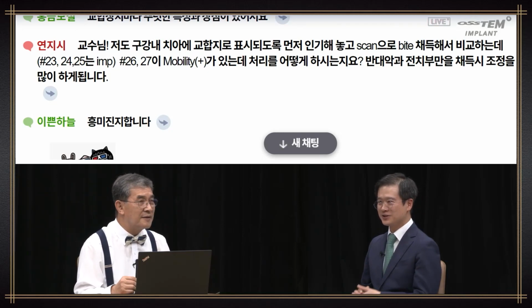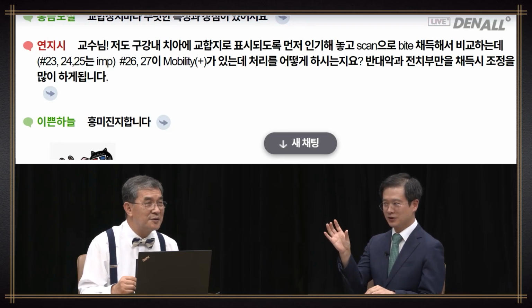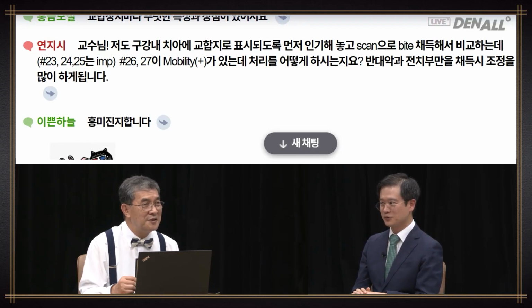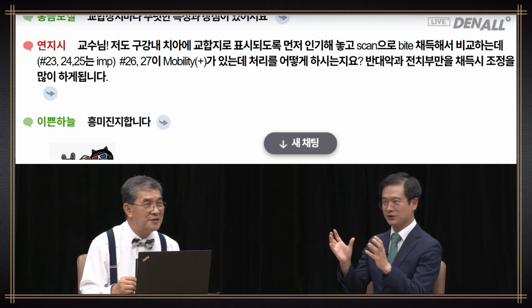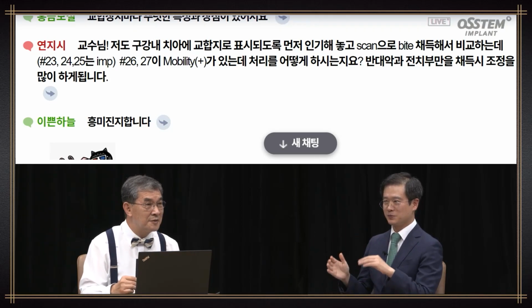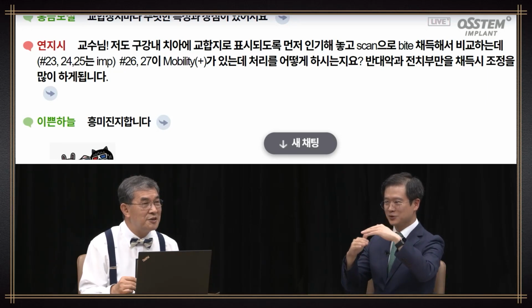When we scan the oral cavity, the patient's mouth is open, so the tooth with mobility is slightly up. If the patient bites, the tooth will be pressed upon. So the scan and bite will be different. You need to scan properly. When you scan the lateral bite, I don't scan the tooth with mobility. You talked about the implant. You need to scan stable area with no vertical movement. In areas with mobility, you should not scan.